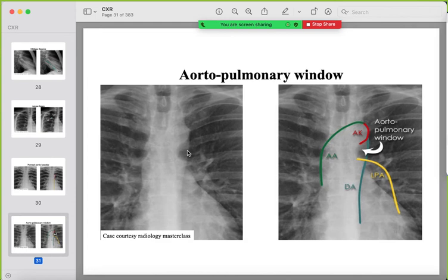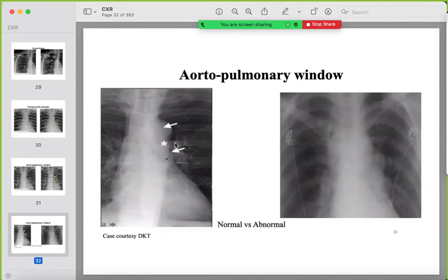The aortopulmonary window is the clear area between the aortic knuckle and the left pulmonary artery. If large lymph nodes are present due to any cause, this window will be filled with soft tissue density and the clear area will be lost. On the normal image this space is clear; any soft tissue density here should raise concern for lymphadenopathy.